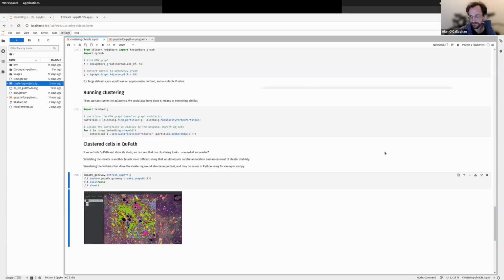Good. Yep. Definitely recommend checking out Thibaut's workshop. It's a really nice and easy to use Python package. The method is really, really exciting as well. I found it really, really useful.